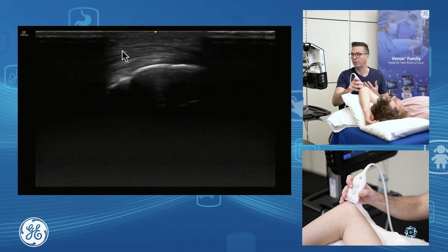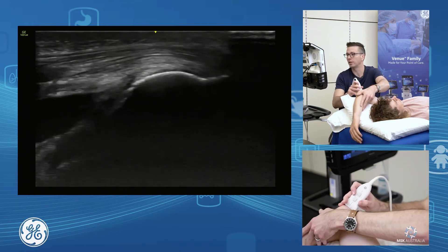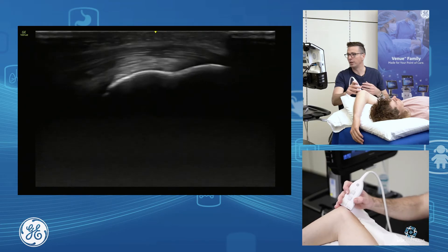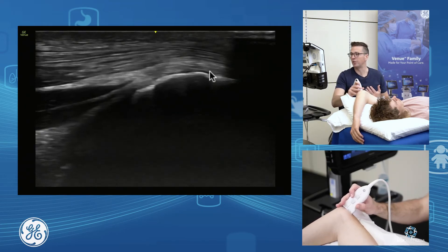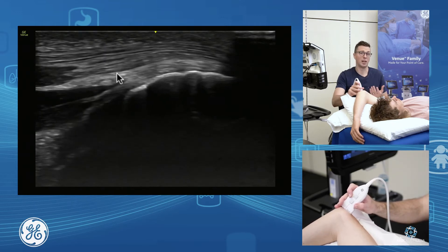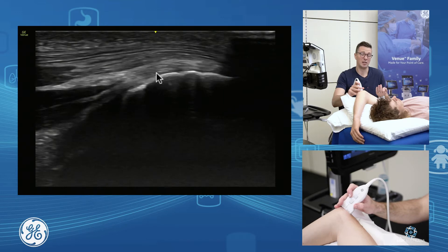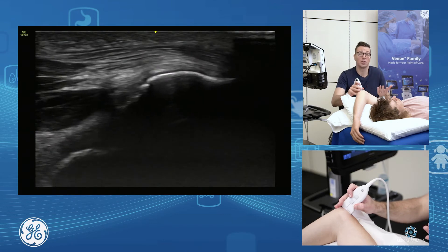Where you have your spurring or enthesiopathy is in the long and lateral heads. The deep component down in through here — your medial head — is a common place to get CPPD depositions. You can get gout or pseudogout depositions within the medial head of the triceps; it's a common place to get it.